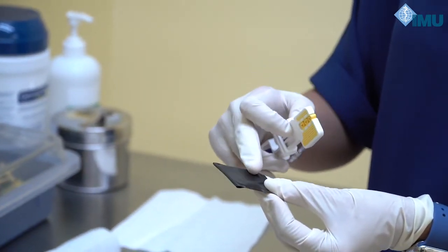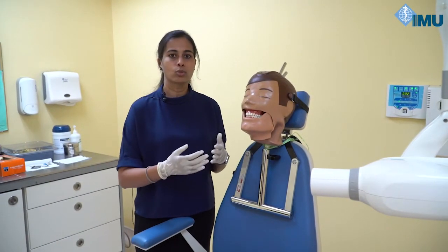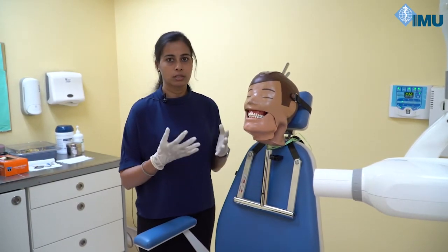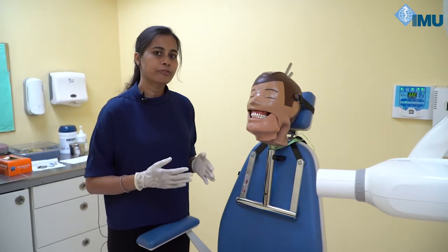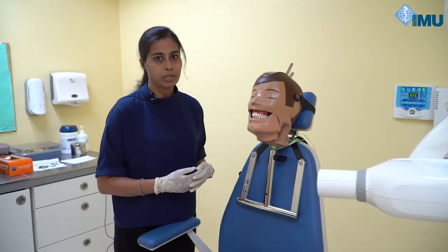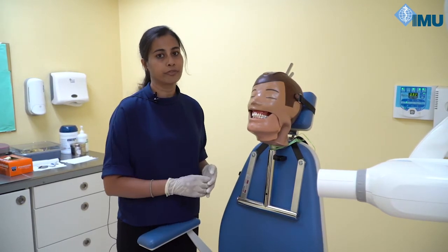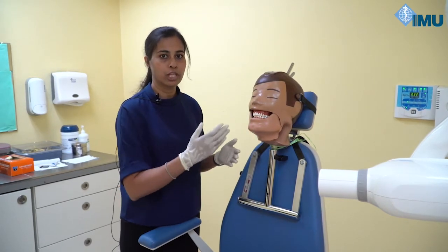In bisecting angle technique, we have to follow certain principles. The technique is based on Cieszynski's rule of isometry. Each individual tooth requires a specific angulation and a specific point of entry. Let me explain the point of entry and angulations for each tooth.